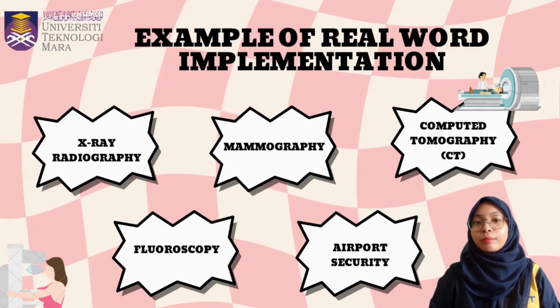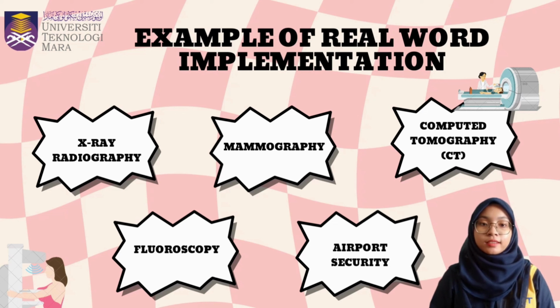Next is examples of real-world implementation. First, X-ray radiography. X-ray radiography is used to detect bone fractures, certain tumors and other abnormal masses, pneumonia, and some types of injuries. Second, mammography. Mammography is radiography of the breast that is used for cancer detection and diagnosis.